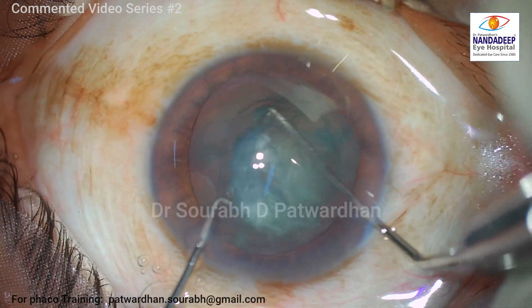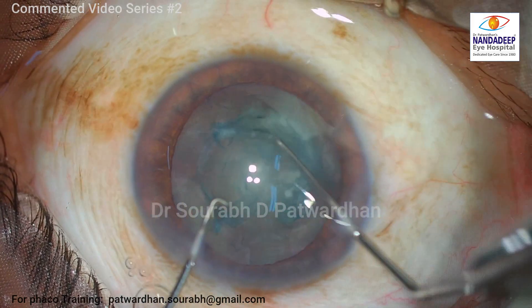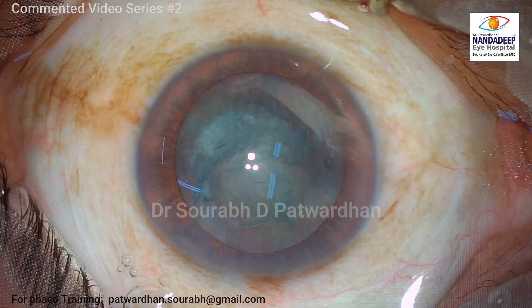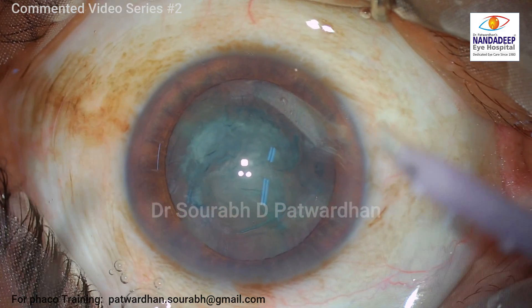I could rotate the nucleus quite easily. It's good if we can rotate it both ways four or five times — that takes care of the cortex, and the cortex becomes quite loose when you do cortex aspiration, which helps a lot.